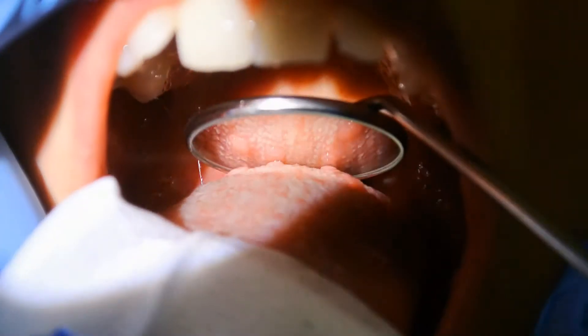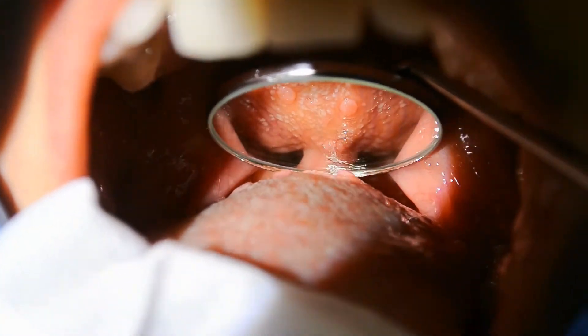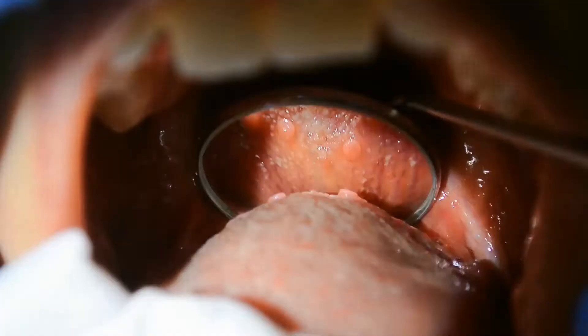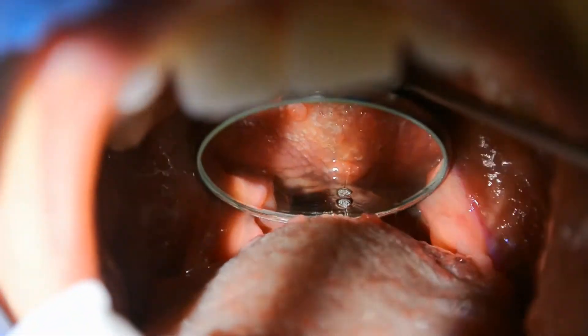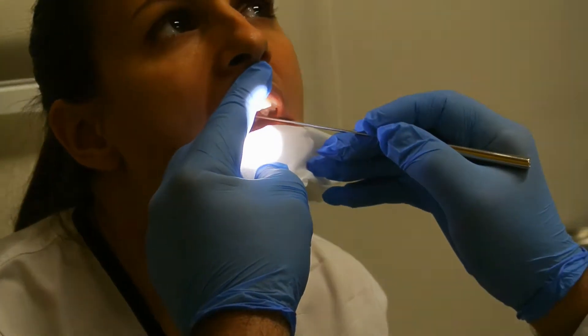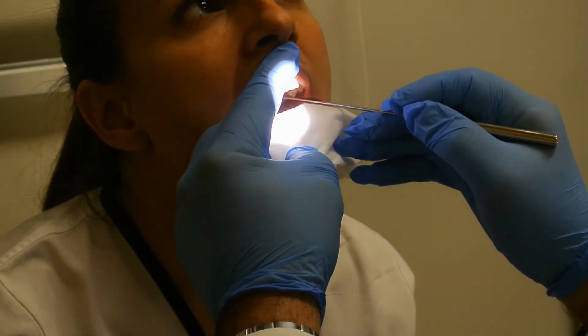We push the mirror till the uvula. We can even touch the uvula or the soft palate with the back of the mirror. We should tilt the mirror approximately 45 degrees in order to be able to examine the larynx.